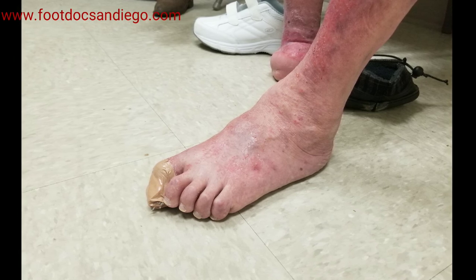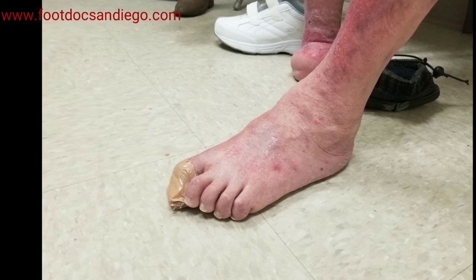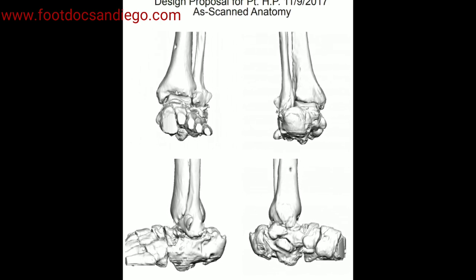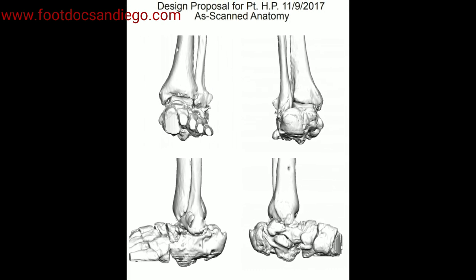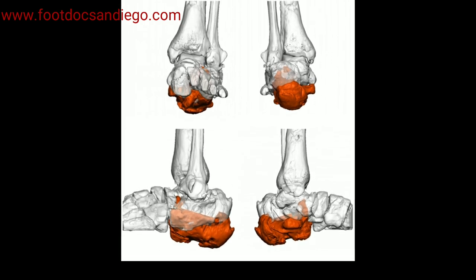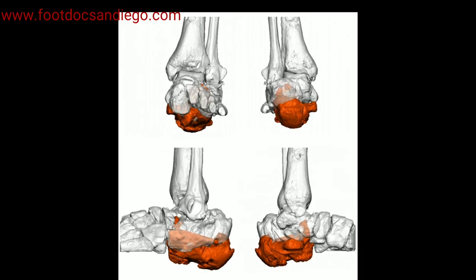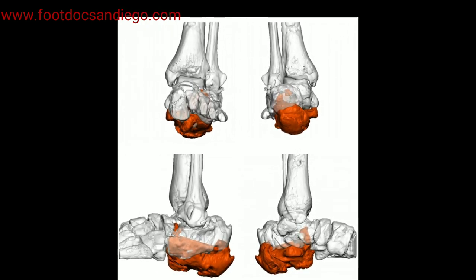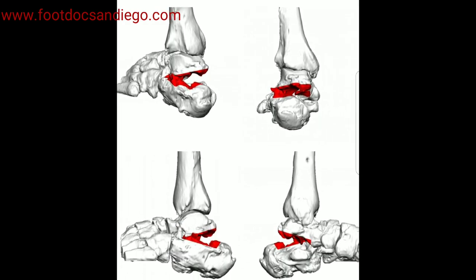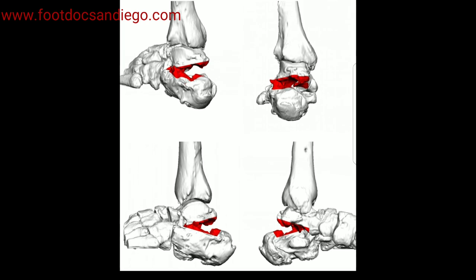There is a company called 4web, and they have the ability to create custom printed implants that will allow for perfect correction based on measurements that are taken. This is really important because you want to take all the guessing out of these surgeries and be able to limit the patient's time on the operating room table and allow them to heal better. Here we will see this is part of the computer program where we take the deformity, open it up, and put the heel bone back in the right position. Then the people at 4web will create the proper implant.